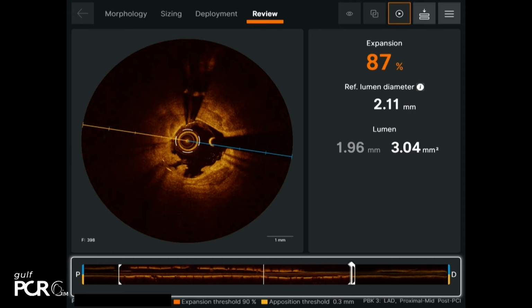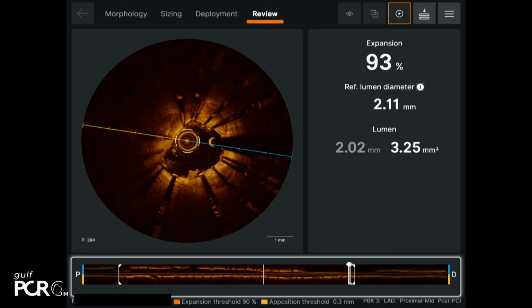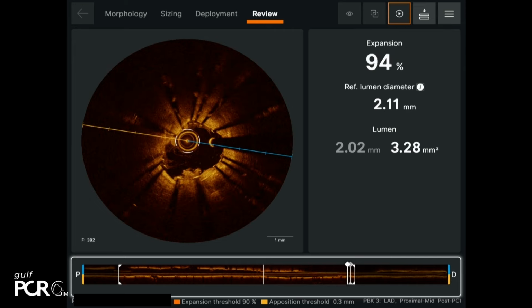There is plenty of thrombus. This is no fragile tissue. This was a calcified vessel. This is a white thrombus, fresh thrombus, forming on the top of the struts. So we needed to open up a little bit more. Now you can see on the right side, where the lumen is written, that the area is 328. 328 plus thrombus inside cannot be left.